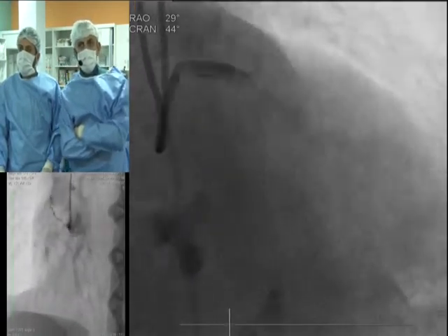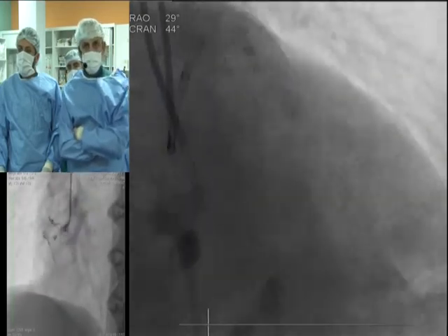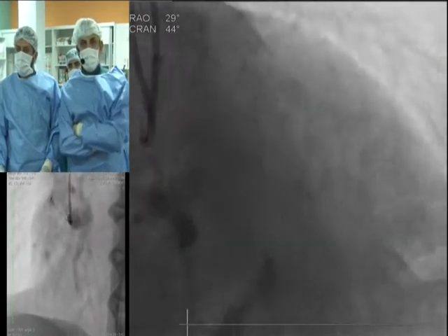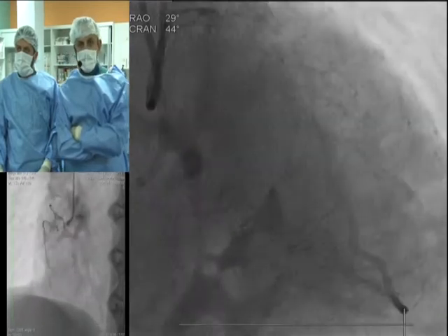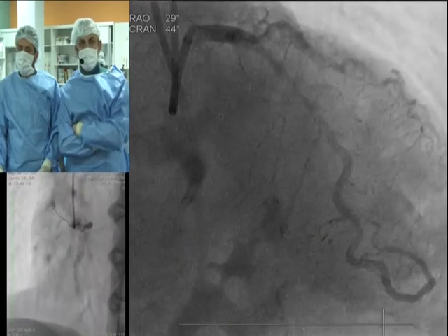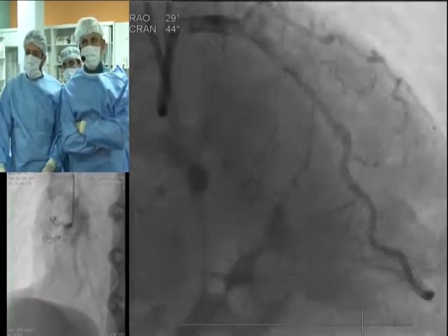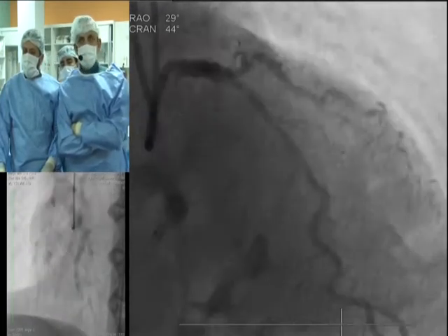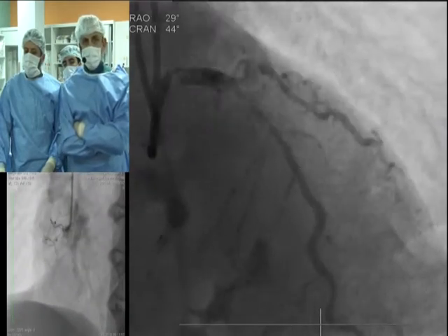It went well up to the proximal part of the occlusion, but then we got stuck there and we had to change our wire to Miracle 6. Miracle 6 also went there, and it went a little bit into the subintimal space, and lastly we used Ultimate 3, which went to the true lumen at the proximal part, and we did snaring of the wire.